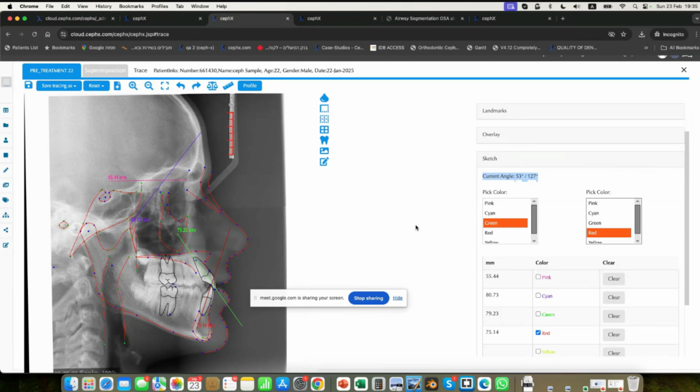Okay, so I think from this point, if there are any further questions, you're very welcome to send them over either via email or via our Intercom icon that you should have on your screen on the bottom right when you log into the system. We'd be happy to help. If you want to trial out the 3D stuff, please let us know. You can upload it directly, or just send it to us and we'll upload it for you if you want to just check it out initially. And then I think we're pretty much good unless there are any further questions.